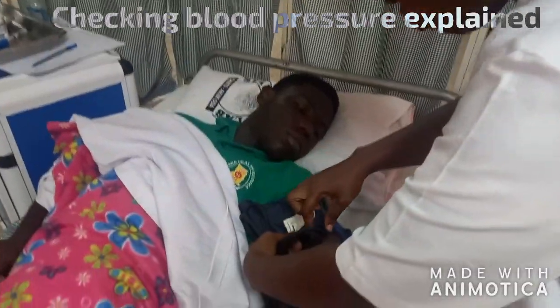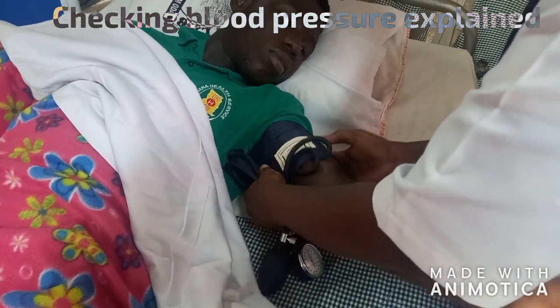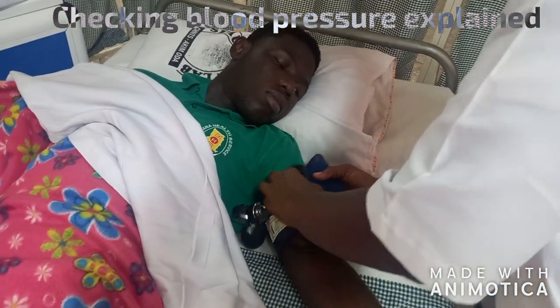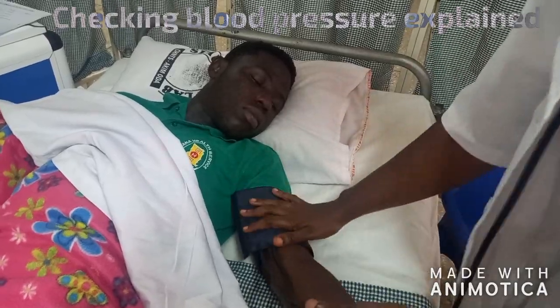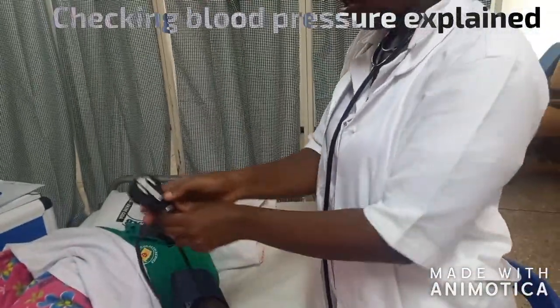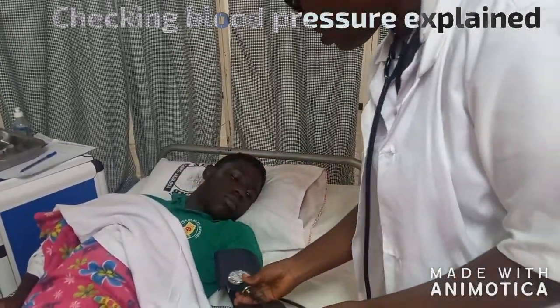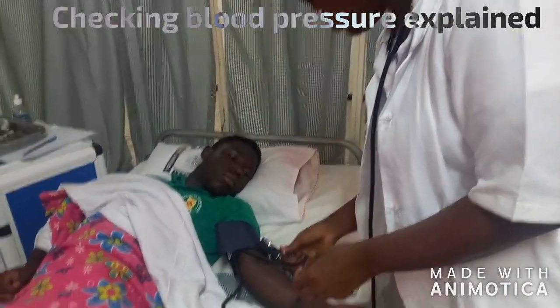This should be here on the brachial artery. Then you do it tight — not too tight, but it should fit the patient. Then, if it's this type you are using, you press here to open the top. And you just put it here where it will be visible enough for you to read the meter.